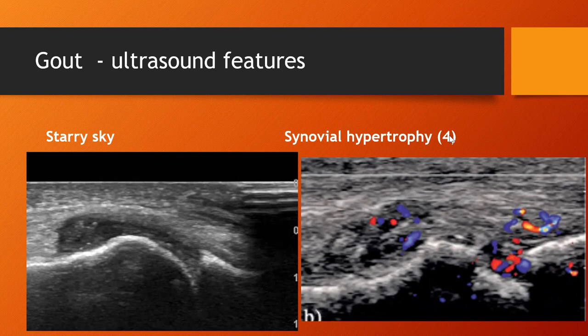So look for positive power Doppler signals, so use power Doppler preferably over colour Doppler. It may be more sensitive. There are new techniques around, of course. There's SMI and ADF, features of the Canon machines.